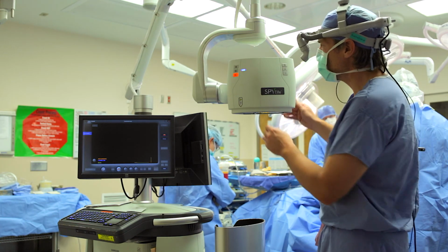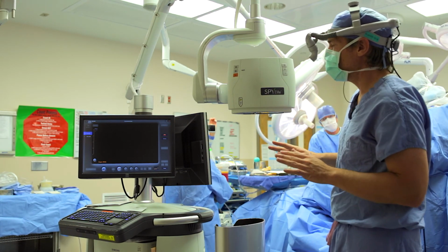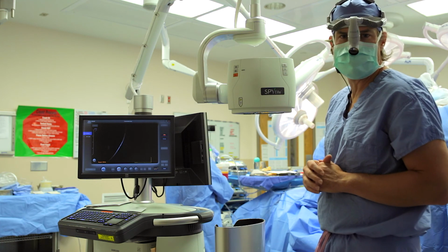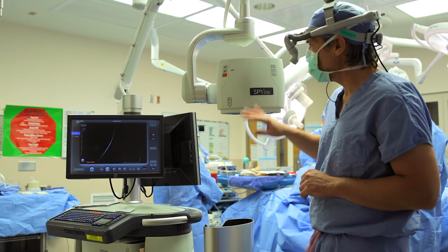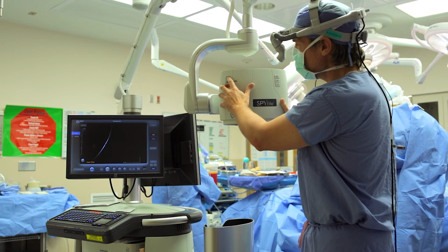When you're done with your SPY study, you hit that button again, and it turns off the laser. It will automatically stop recording at 130 seconds if you don't do anything. That then is saved as a file on the machine. Okay? Couple other buttons here to activate.